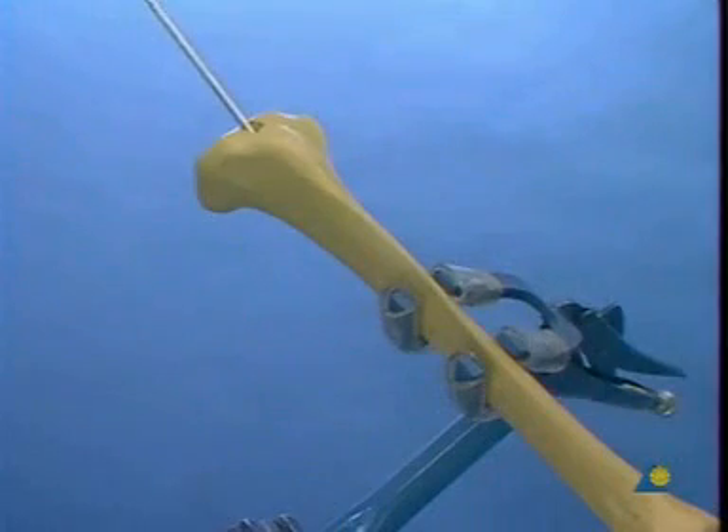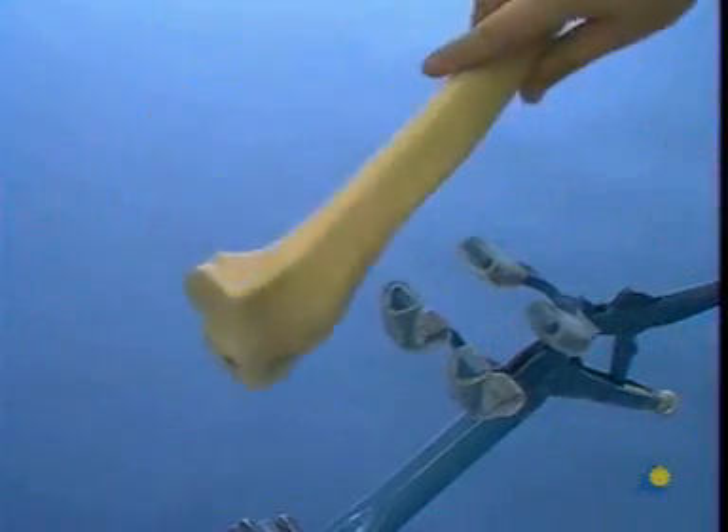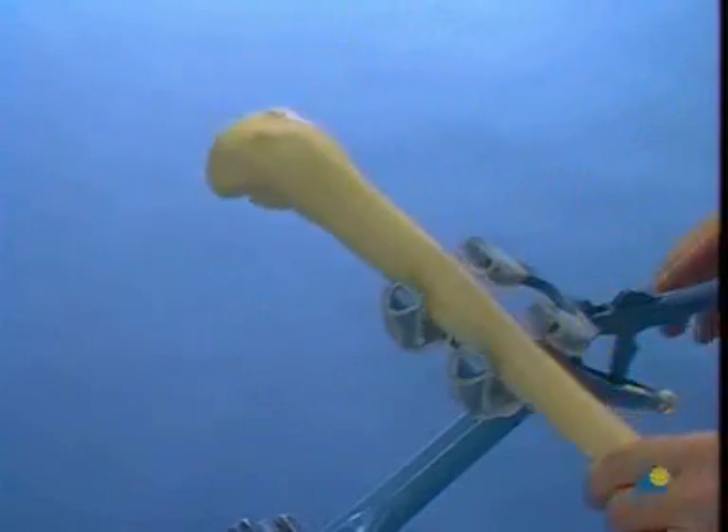On the artificial bone, the bone plug cut by the cannulated cutter does not always come out with the cutter. If this occurs, the bone must be unclamped and the plug of cancellous bone removed.